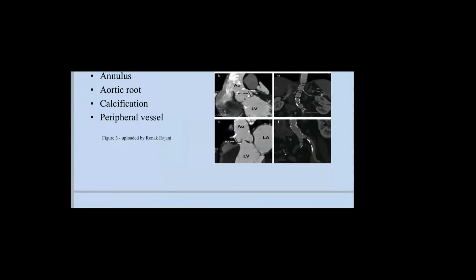We are trying to take over from CCT, but we can't yet. So CCT is the default. You go for TEE if you don't have a CT facility, possible, but you have to be aware there is a margin of error of at least 10% when using TEE, even if you do it the best. And cardiac CT is the best here in quantification and parameter assessment.